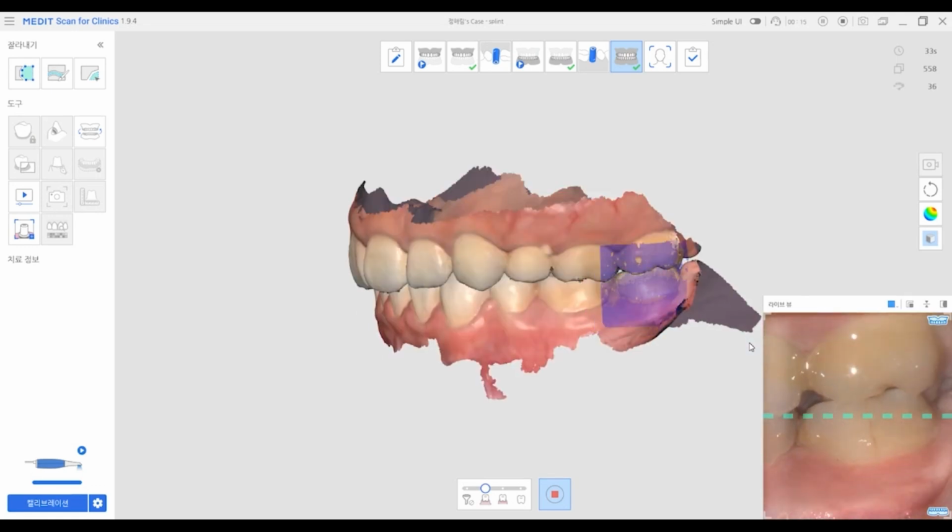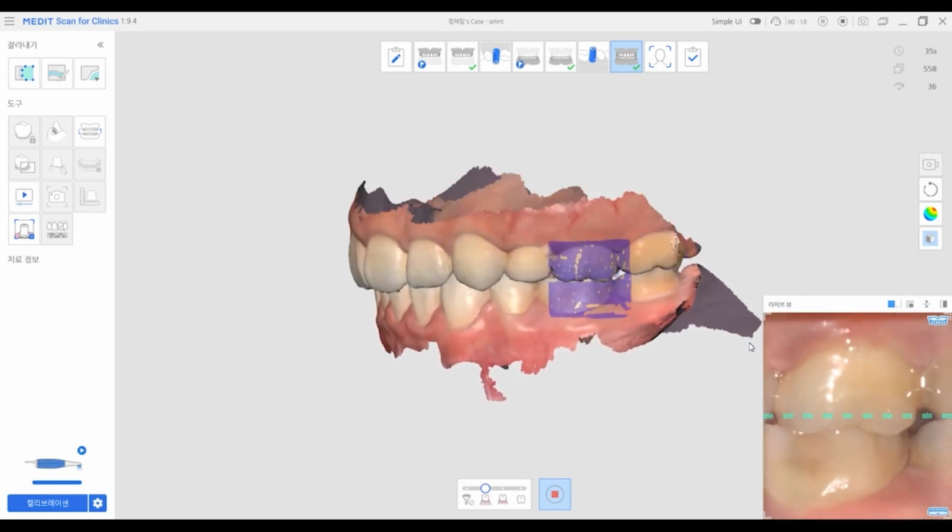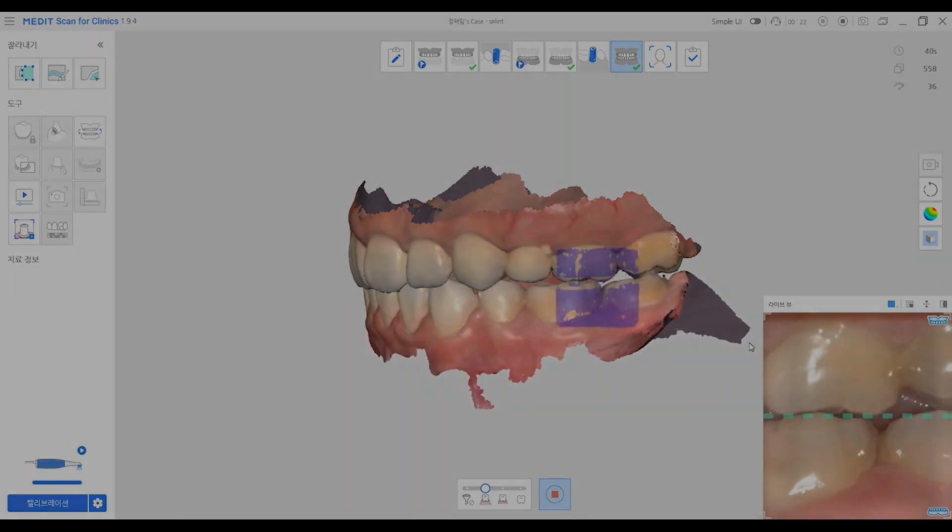Mandibular movement recording is a crucial technique for reducing occlusal adjustments in splint design by precisely documenting how.